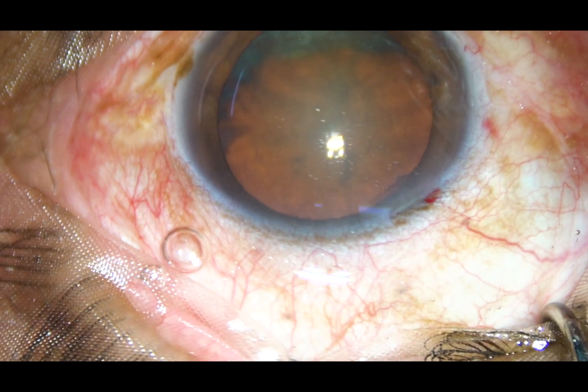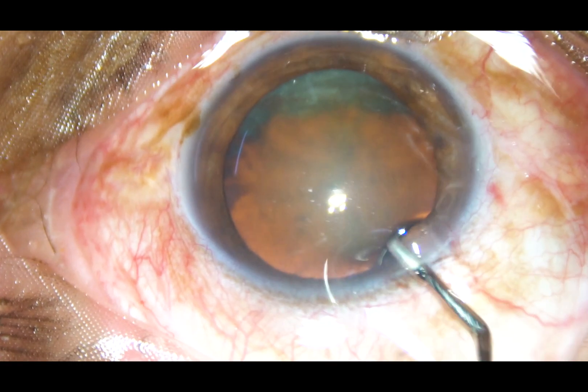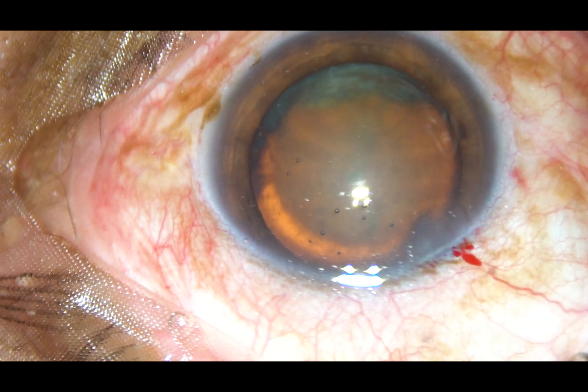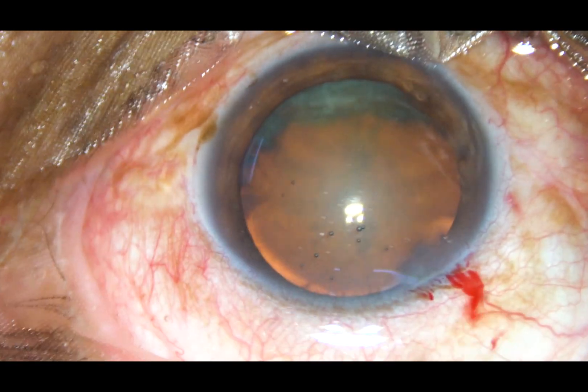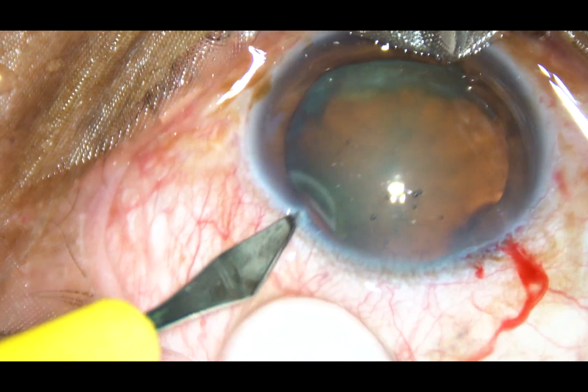The main incision has been placed on the posterior aspect of the limbus and now viscoelastic substance is injected into the anterior chamber. One side port is made on the left side of the main incision.